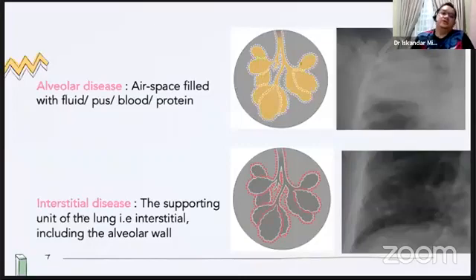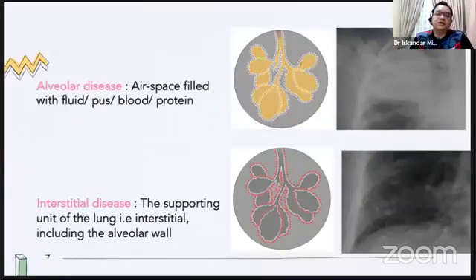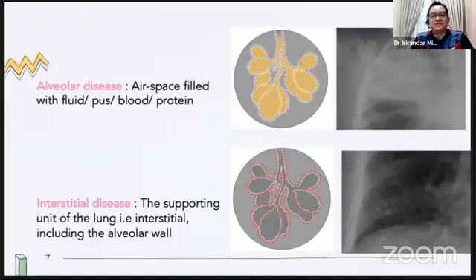Yes, so this is my experience, which is not much. I was also thinking about whether the PKRC's Cat 1 and Cat 2 patients need to have an X-ray first before we send them there. There's another thing, no? Because now the variant is quite aggressive compared to the previous one. Before, we really had to look carefully to see some form of patchy changes, but nowadays it's open straight away and I have to report this.